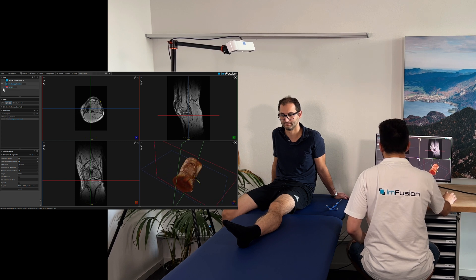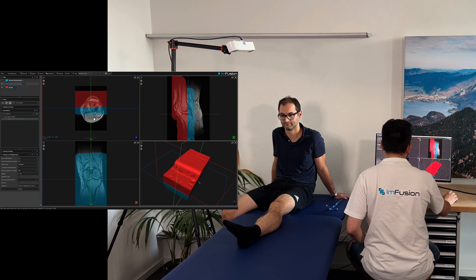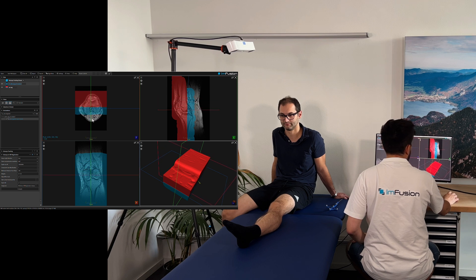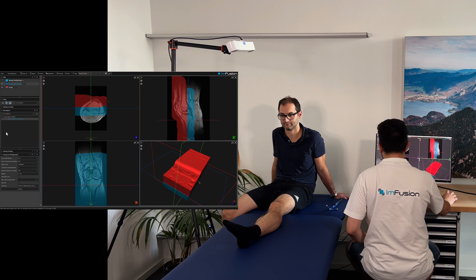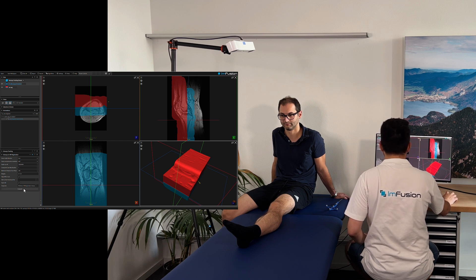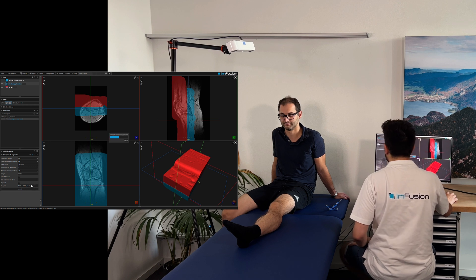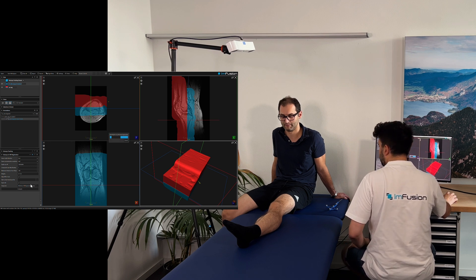The masks you see here indicate different weights for different parts of the scan. The red part is given a higher importance than the blue part during registration to focus on bony structures. For this demo the masks have been defined manually, but for other applications custom segmentation schemes based on our framework can be utilised.